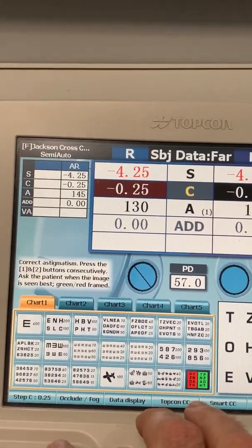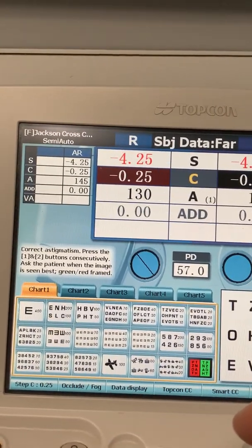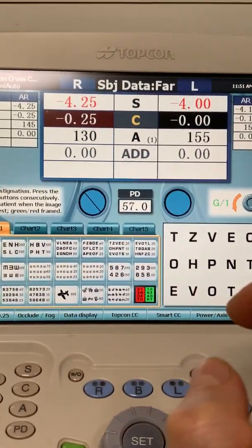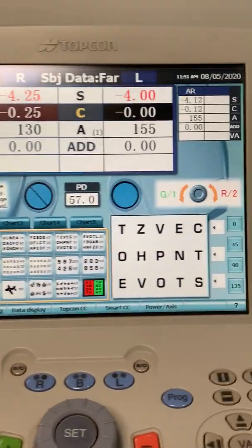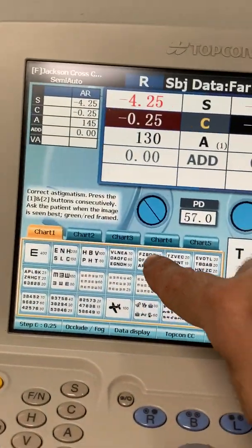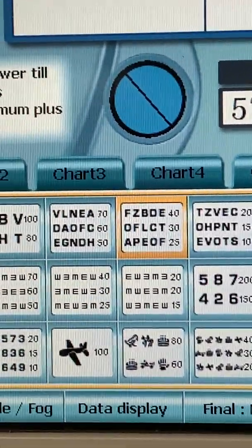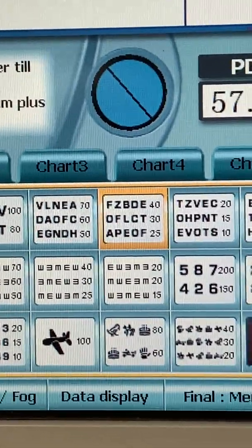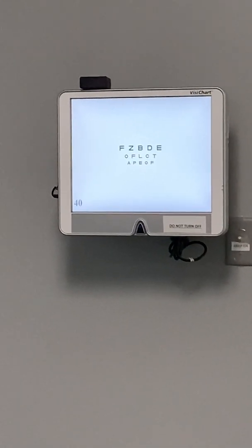You just hit it again and it goes back to minus cylinder, so it's not that difficult to deal with. Now, one other cool thing — here's our eye chart. There are various screens, and a very common screen has 20/40 up at the top and 20/25 at the bottom. I just hit that there, and there it is: 20/40 on top, 20/25 on the bottom.